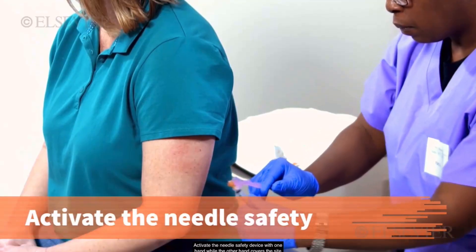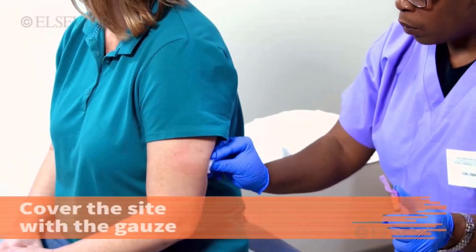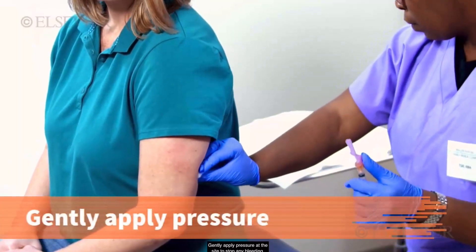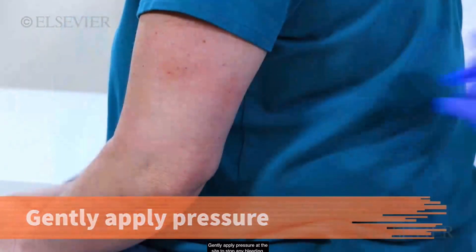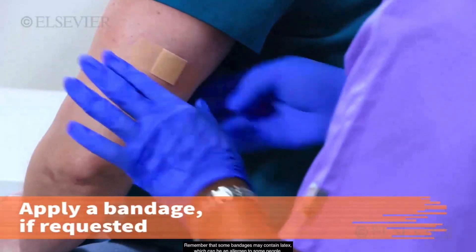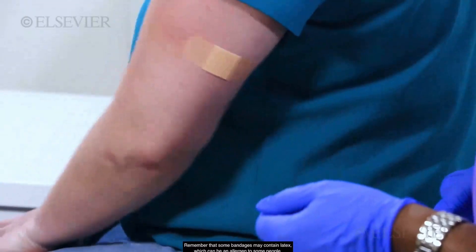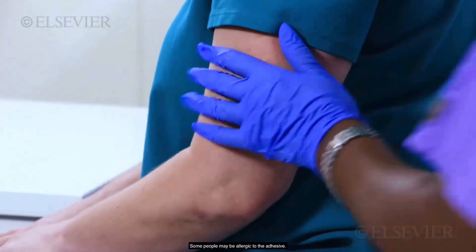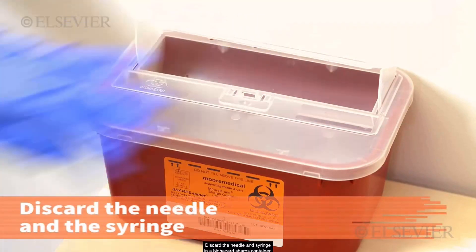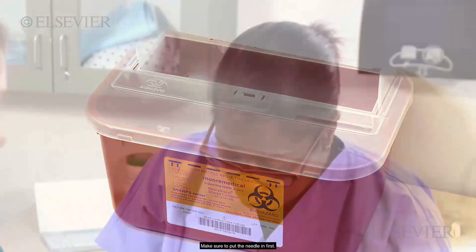Activate the needle safety device with one hand, while the other hand covers the site with gauze or a cotton ball. Gently apply pressure at the site to stop any bleeding. Apply a bandage if the patient requests it. Remember that some bandages may contain latex, which can be an allergen to some people, and some people may be allergic to the adhesive. Discard the needle and syringe in a biohazard sharps container, making sure to put the needle in first.